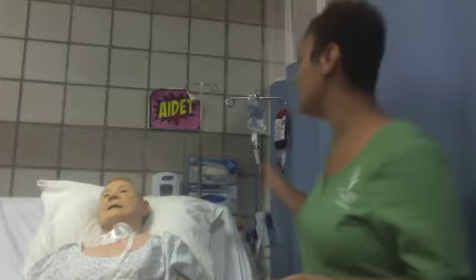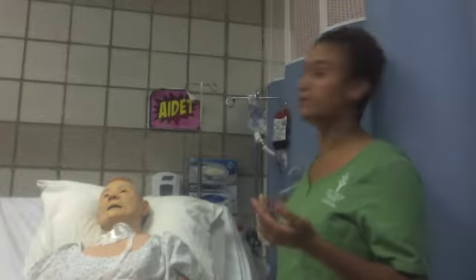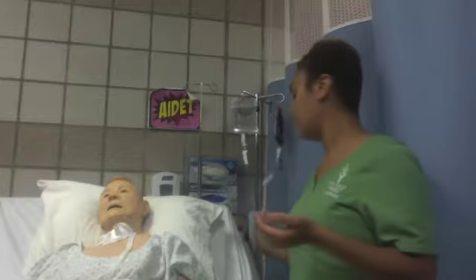If this was a drip by gravity, I'd be counting the drips. I would have, before I stabbed my bag and hung it up, I would have closed off the clamp to the saline and then to the clamp that's below the drip device or the machine. And then I would have made sure that all the other subsequent clamps have been closed. Then I would have spiked the bag, hung it. Okay.